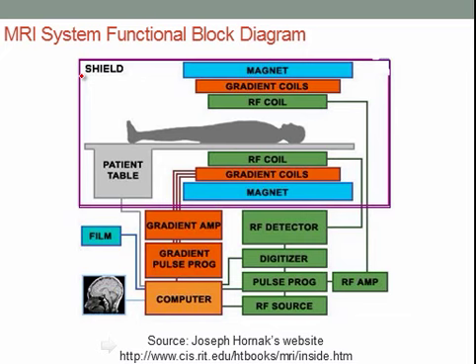So maybe you can get something from a TV or an FM radio station, if it was strong enough, leaking into the room. But with the shield there, you will not get any RF into the room, because you don't want any RF in the room being picked up by the RF coil, because if it gets picked up by the RF coil, that signal will look like an artifact in your image.